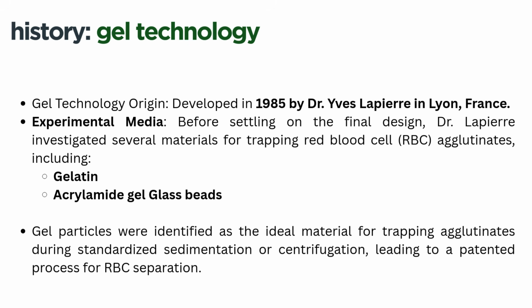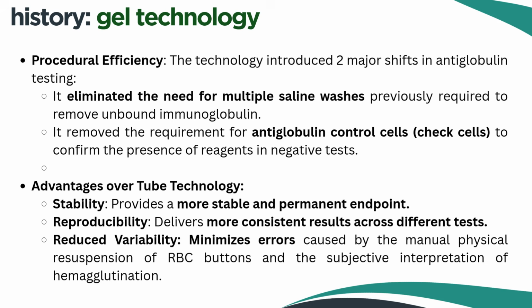As we move forward, guys, we'll explore how these advances in gel technology have continued to evolve and their significant impacts on procedural efficiency. The procedural efficiency brought about by gel technology and antiglobulin testing is quite outstanding. This innovation led to two major shifts. First, it eliminated the very cumbersome process of multiple saline washes to remove unbound immunoglobulin. And this not only streamlined the testing process but also reduced the potential for user error.